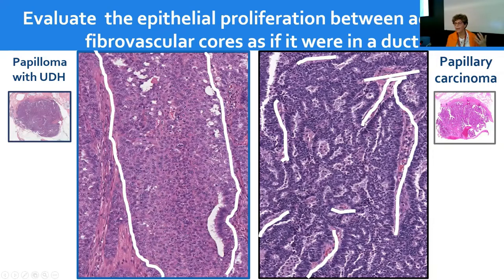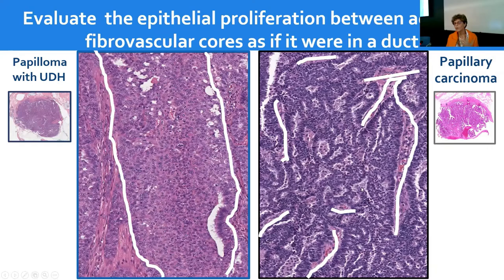In a carcinoma, the fibrovascular cores may not be so obvious—they can be very delicate and filiform—but I still draw imaginary lines and evaluate the space between adjacent fibrovascular cores. This proliferation, for example, is fairly monotonous, appears cribriform and punched out in some areas, qualifying as a carcinoma. If I had it in a duct it would be atypical, but given the extent, it's a carcinoma, and I classify it further as a papillary carcinoma. A simple but useful approach.